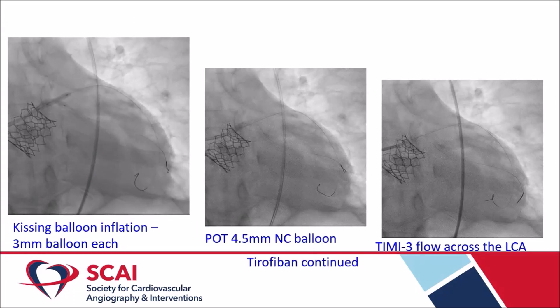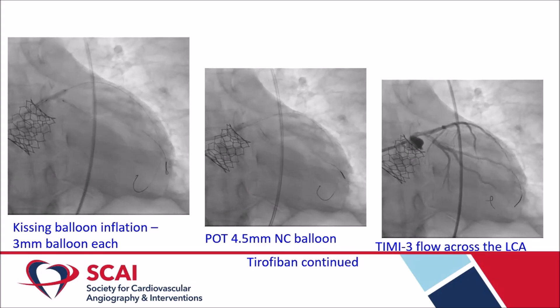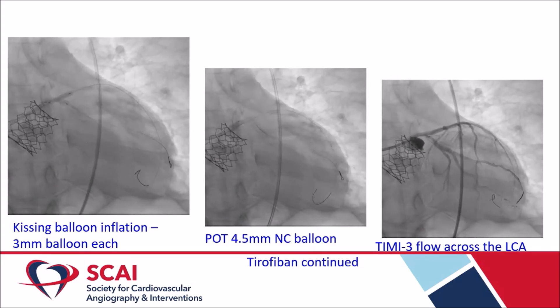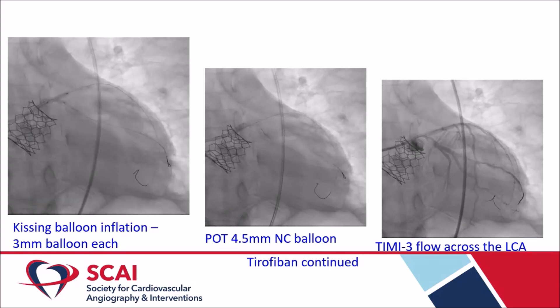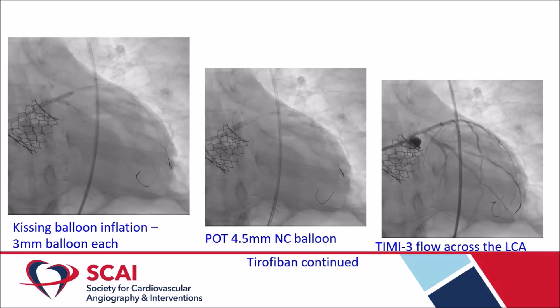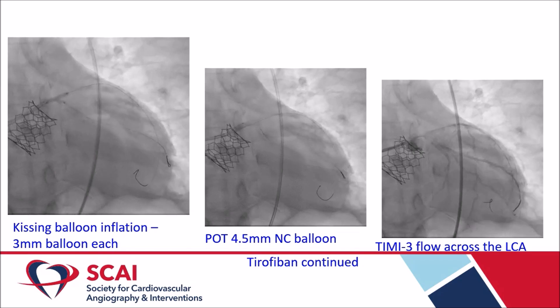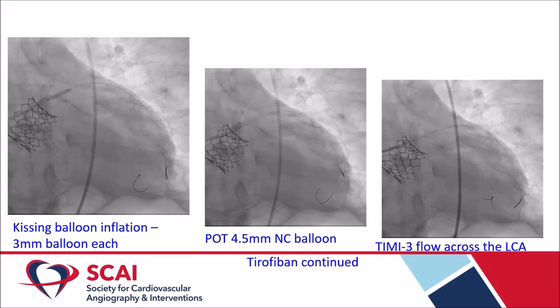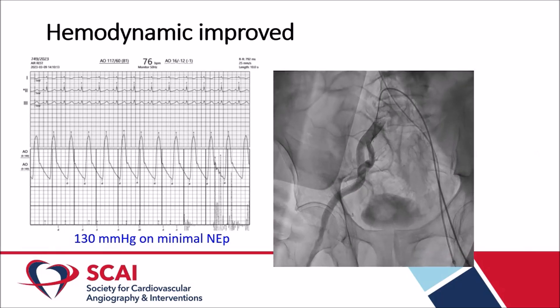The LCX was rewired and dilated with a 2.5 mm balloon, after which flow was achieved across the left circumflex. A 3 mm kissing balloon dilation was performed across the left main bifurcation using a 6F guide catheter. POT was done with a 4.5 mm balloon, achieving TIMI 3 flow across the left system. Some haziness at the ostium and proximal LCX prompted tirofiban infusion. The access site was closed with a ProGlide device.